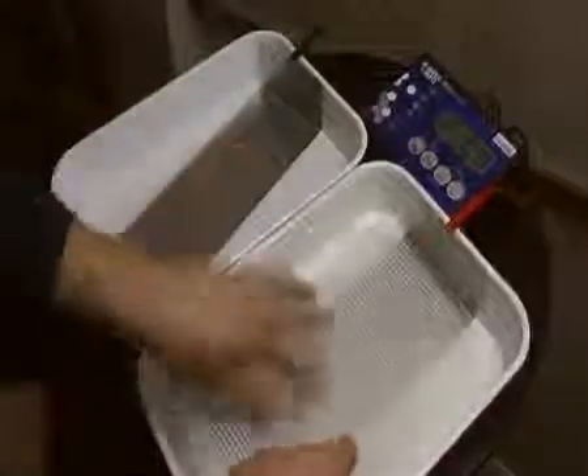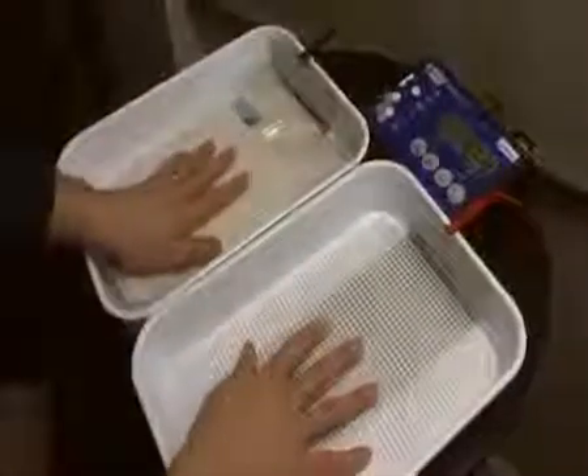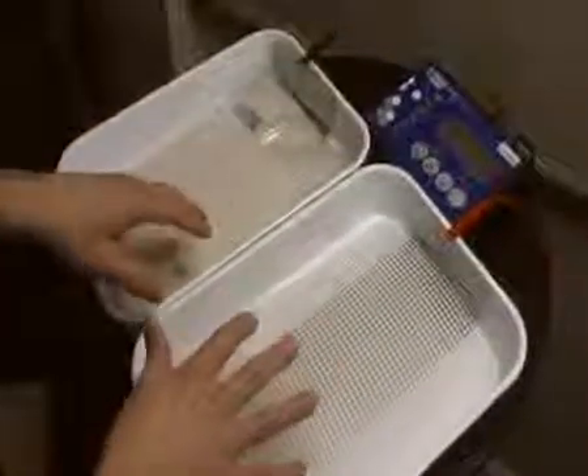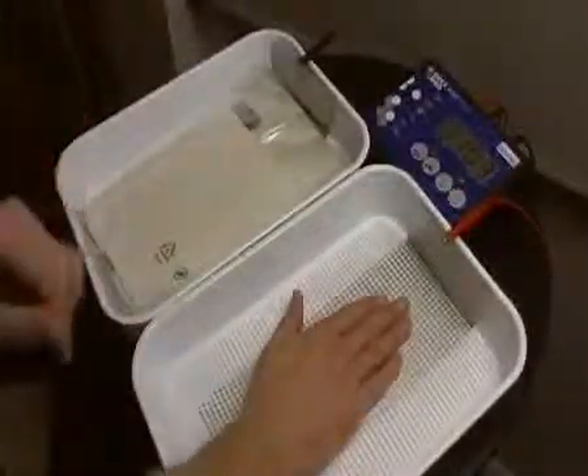You're going to put some water in here — just standard tap water. Depending on your setting, if you're in hospital you'll probably get plastic distance grids. If you're buying a kit for home use, you'll get one of these towels. It doesn't really matter — it makes no difference to the outcome of the treatment. Basically all it's there to do is to stop direct skin-to-metal contact; that's the only reason they're there.